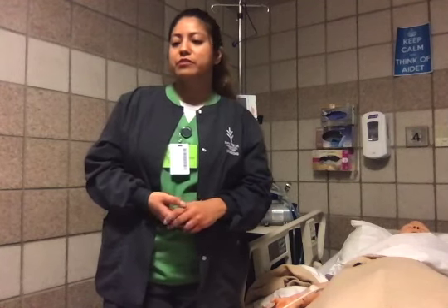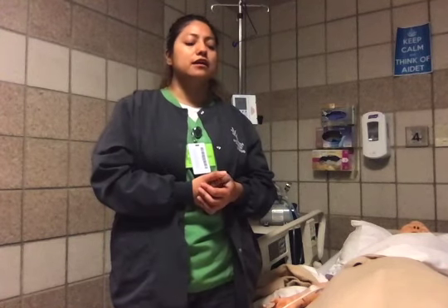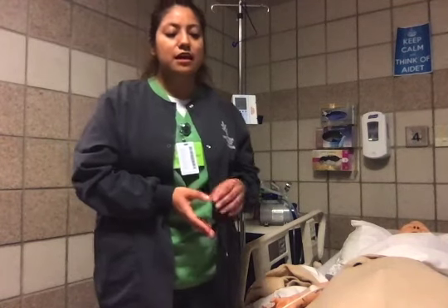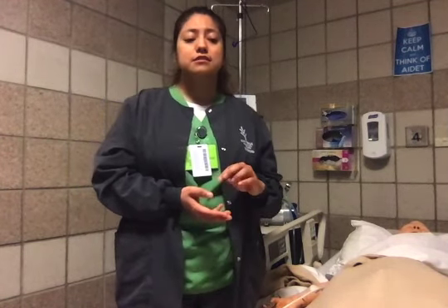So I'm going to prepare myself to hang the medication, and while I'm doing this, I'm going to talk a little bit about my medication. It's an antibiotic, and it's part of the penicillin family, so always know that this can cause rashes, anaphylaxis, and GI dysfunctions.